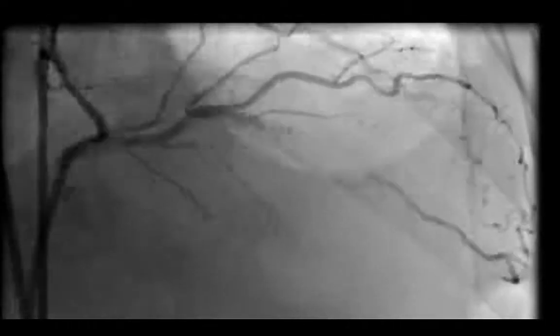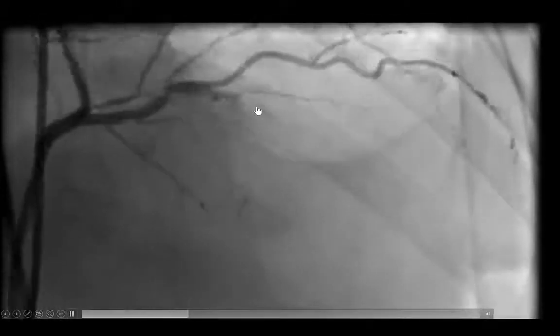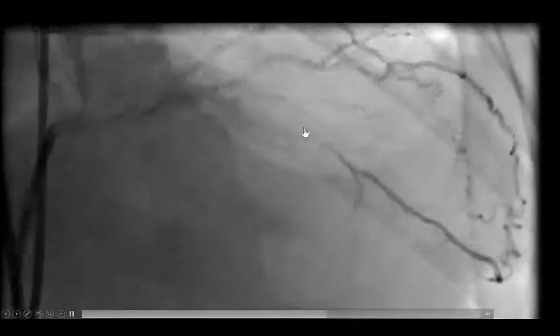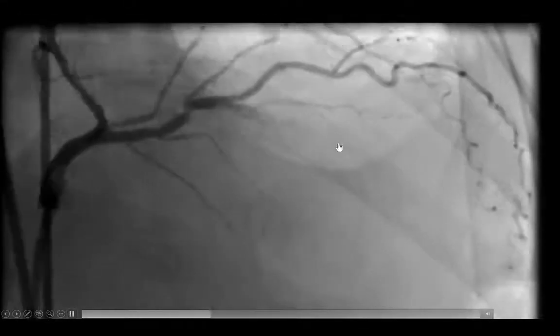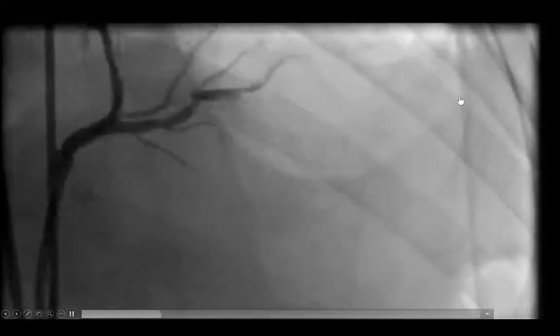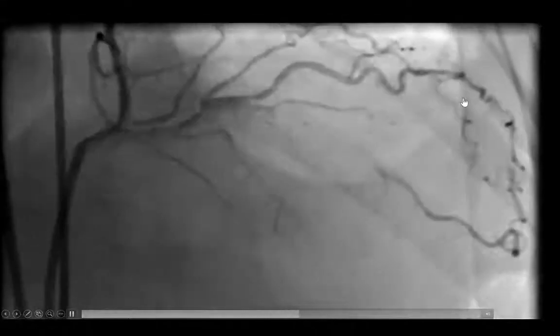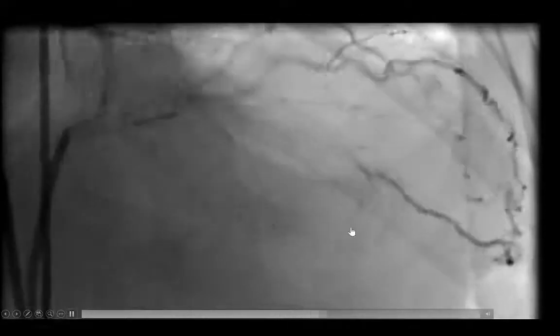This patient had an LAD CTO with a well-defined tapered entry proximal cap. The occlusion appeared to be relatively short, less than 20 mm. The distal vessel was of good caliber, although there was some calcification throughout the vessel and the CTO segment. There was no previous failure. Collaterals were coming from the same side, but were tortuous and small, not appearing very appropriate for retrograde crossing.